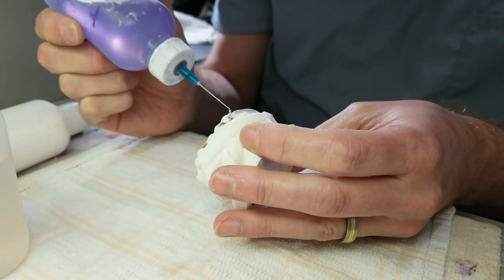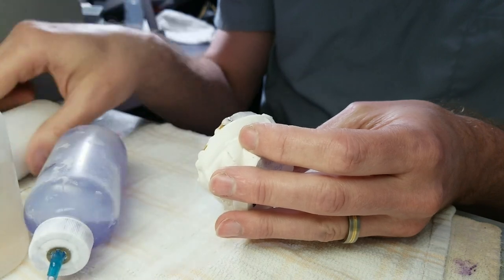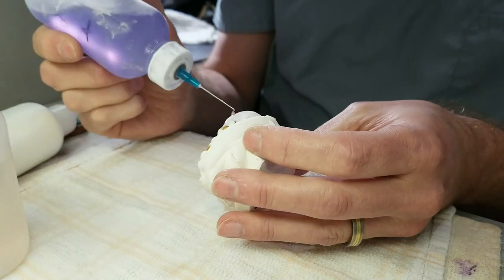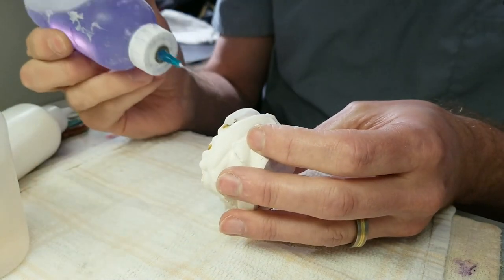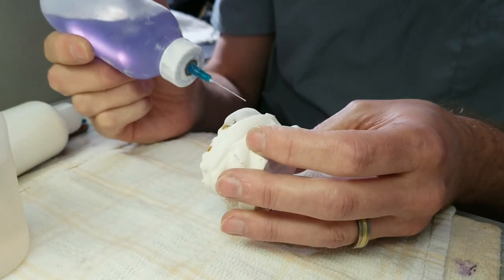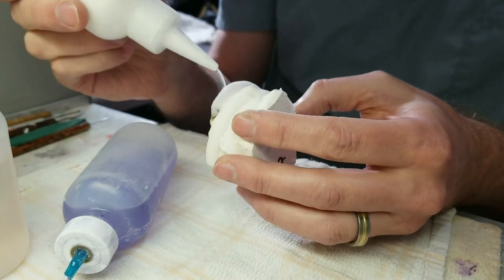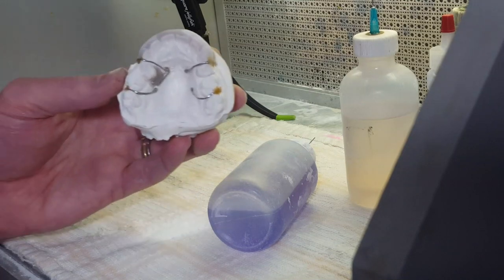I won't be able to change camera angles as much as I want, but you should get the idea. The bottles I'm using have needles on them — these are Boston Round plastic bottles. You can find them on Uline.com. As you can see, that labial acrylic is pretty thick.